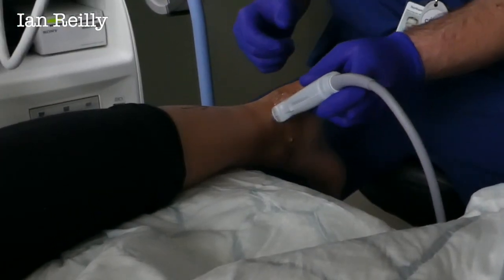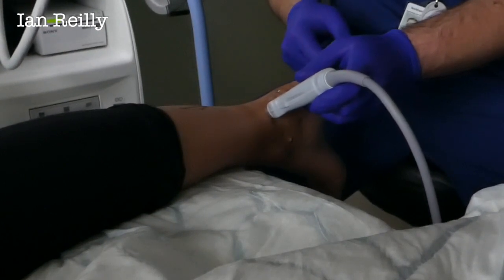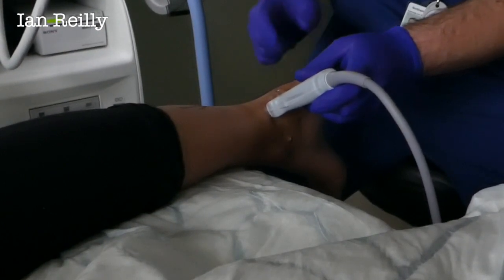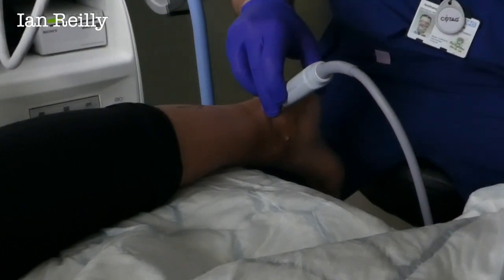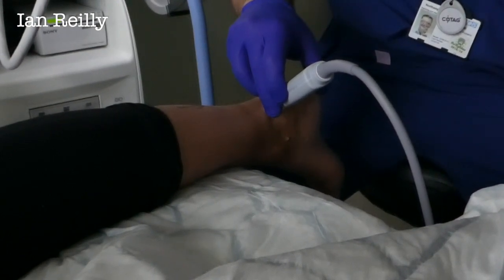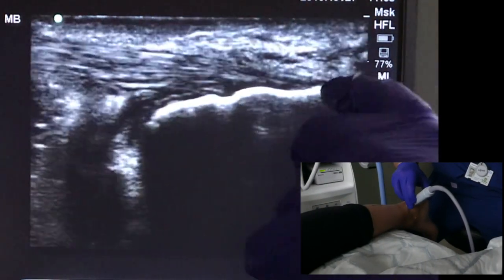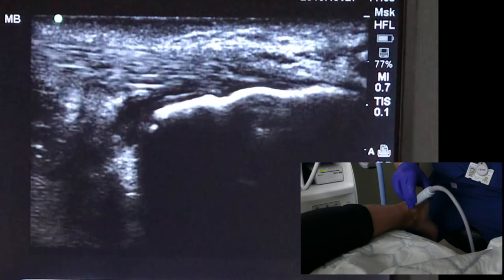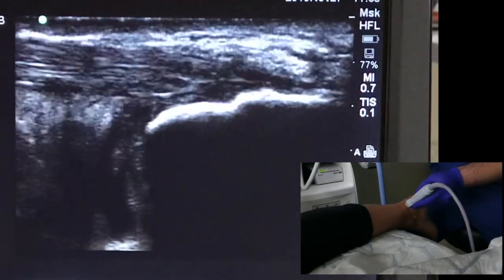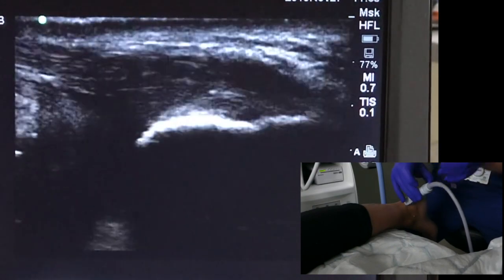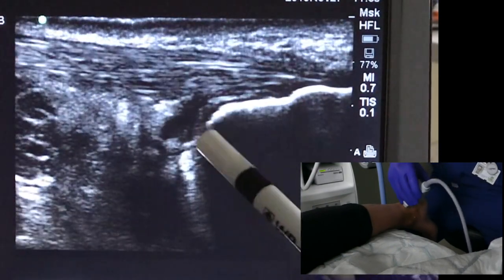Okay, so we're just scanning the posterior heel. This patient's known to have an inflamed retrocalcaneal bursitis. We can see quite clearly we've got a thickened Achilles; we've actually got a pre-Achilles bursa slightly back, but more so we've got this florid bursitis coming off the posterior aspect of the heel. Here's the cortex of the heel. George knows he must point not with his finger but with a pen.